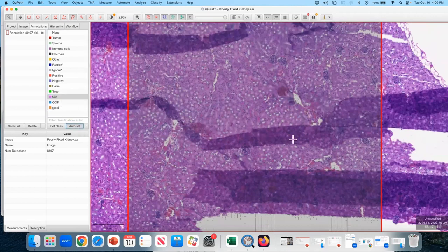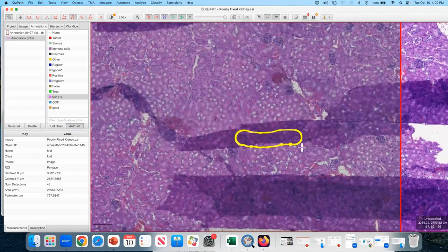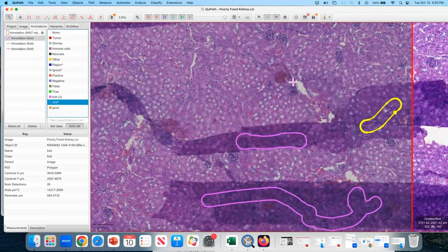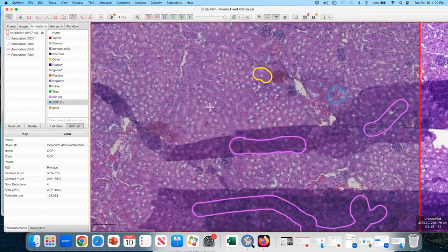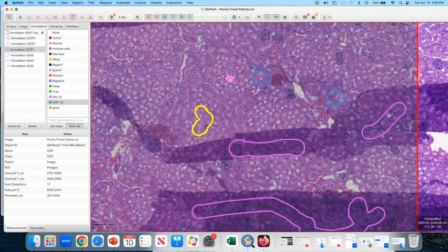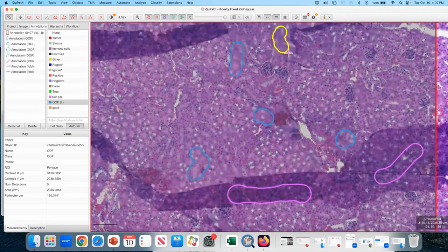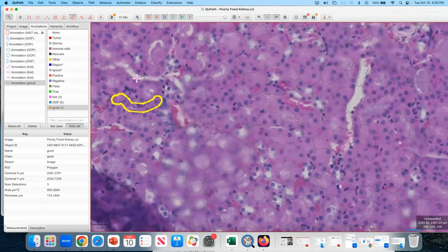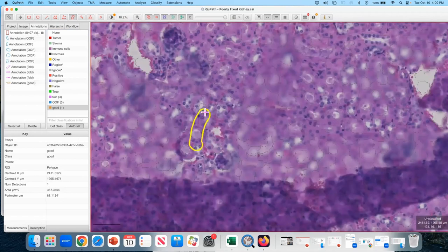Then auto set, here's some folds. Clean up that edge. Got it. Oh, I'm hitting Alt and not Option. Fold. Out of focus, it's like this thing, this thing, and this thing. And here. And good tissue is like this. Sparse, but there are some spots. This, and all of this.